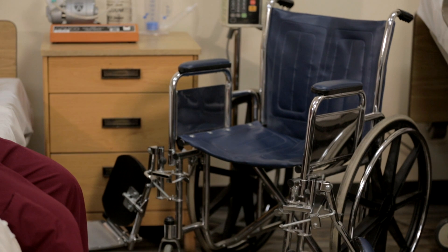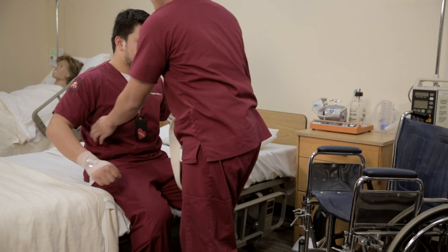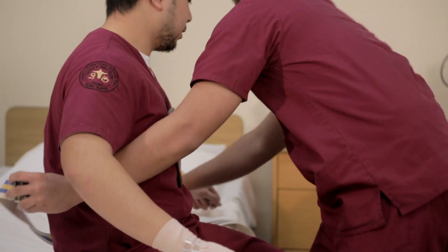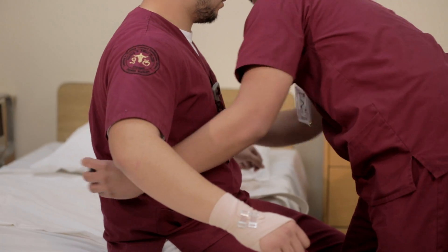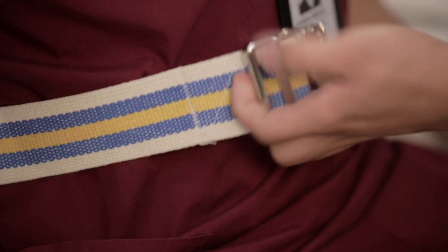In this case, it's going to be the patient's left side. Place the wheelchair at a 45 degree angle to the bed, making sure that the brakes are locked and the footrests are up to avoid injury. Assist the patient to the edge of the bed with the feet dangling, placing the gait belt around your patient's waist snugly enough for your fingers to fit underneath, but tight enough that it does not slide down.